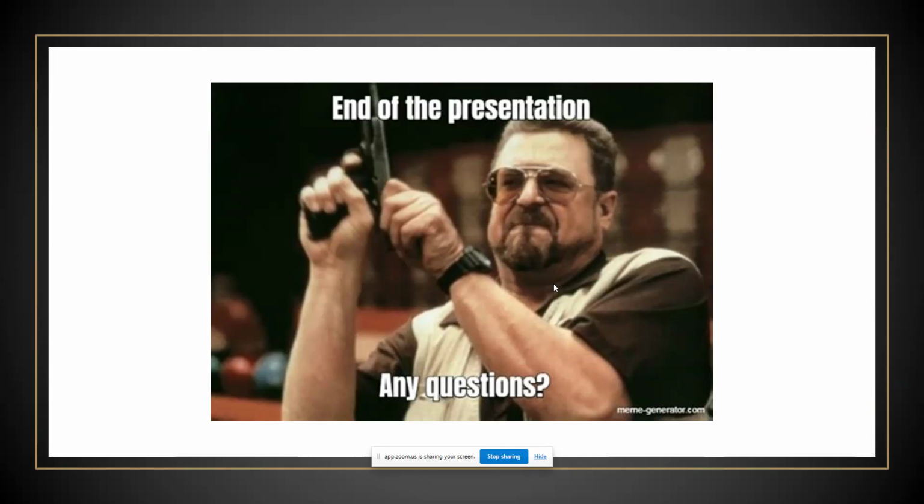And so if the ears are discharging, can we get the ears dry first before we go to implantable? Is it aidable or not, based on the speech discrimination score and the SRT? So all of that. And I think it's quite important that they understand that there's a process rather than just, oh, maybe it's a bone bridge. Maybe it is a very academic discussion and a multidisciplinary team approach with the audiologist and an otologist to see what can be done surgically in terms of just a pure otological procedure, or maybe an ossicular reconstruction, or maybe a meatoplasty to stop the ears from leaking or make the ears more aidable versus an implantable hearing aid.